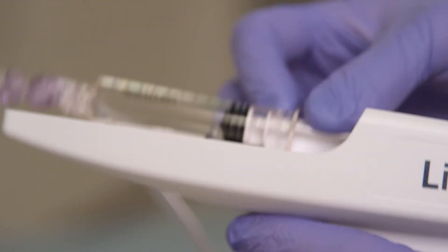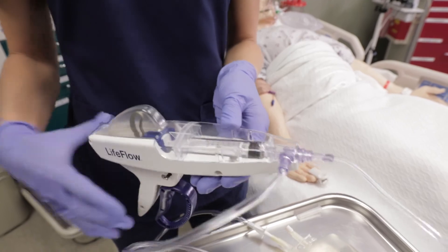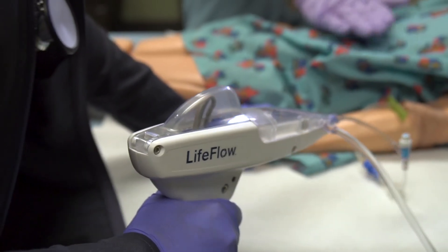Not only is this device easy to use, but it's portable. I can take it to CT, ultrasound — we can even run to the OR with it without having bulky machines that we're trying to drag along behind us. Now that we have Life Flow at our disposal, it's my number one go-to for rapid infusion.